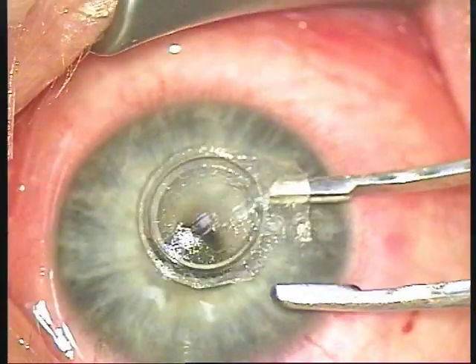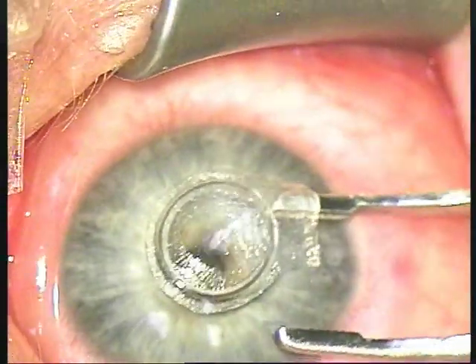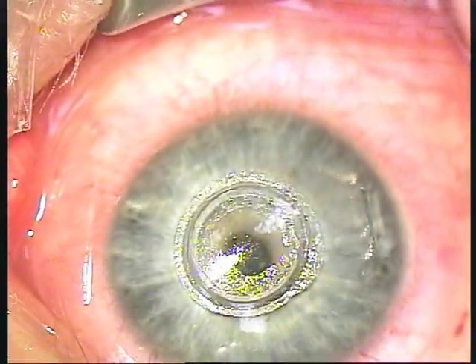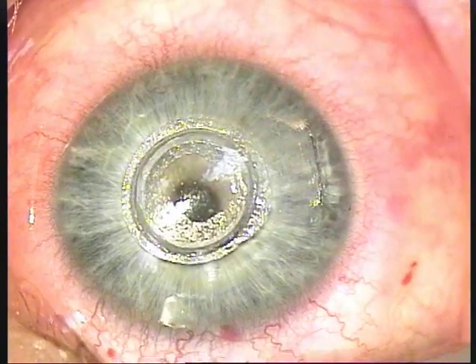The myo ring can be positioned within the pocket. The pocket is closed all around and therefore preserves the biomechanics of the tissue.